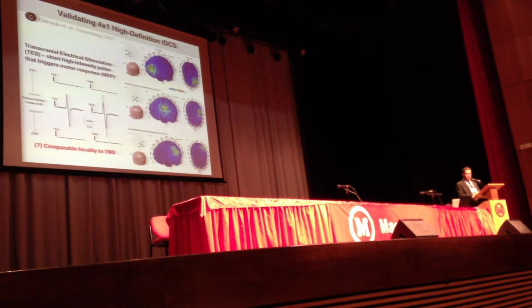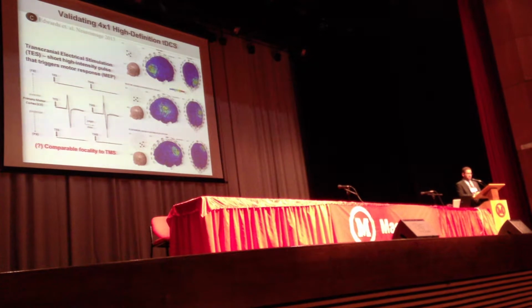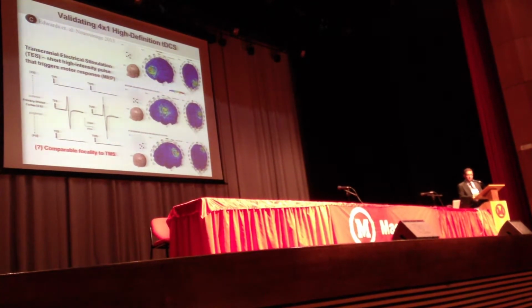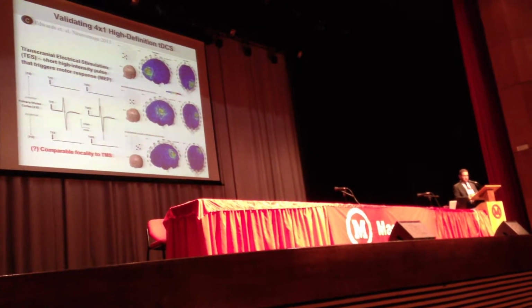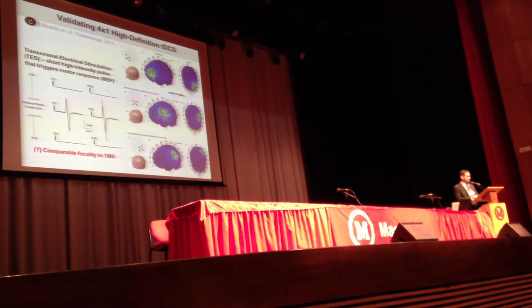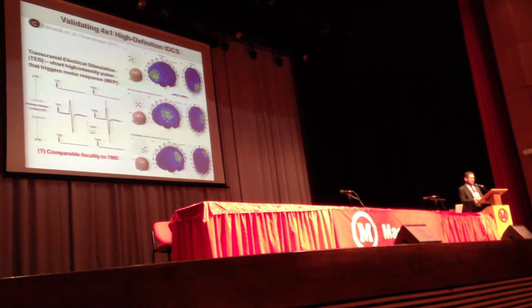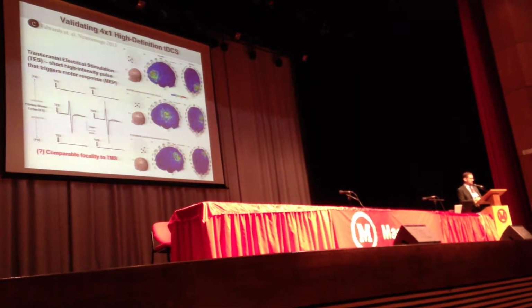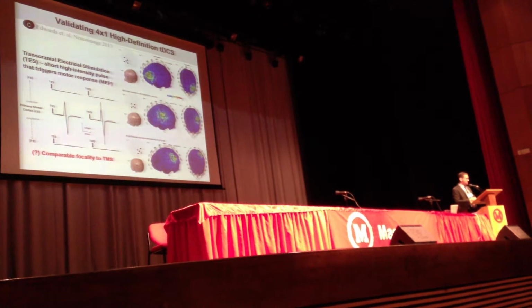The next study I want to talk about was conducted by Dr. Edwards at the Berkeley Rehabilitation Institute, and we'll be hearing from him later in the afternoon. There's a bit of information in this slide, so I'll just unpack that piece by piece. One of the problems with tDCS is that it does not produce an overt response the way TMS does. So if someone's getting tDCS, you sometimes would ask yourself, is it working? Well, with TMS, you get a motor twitch, so it's very convincing.